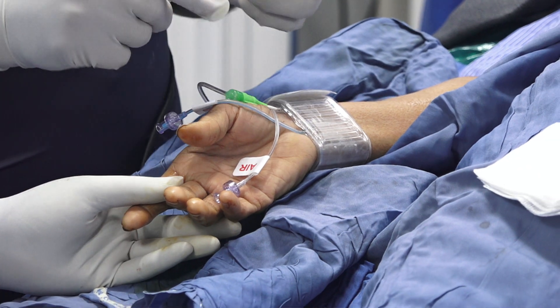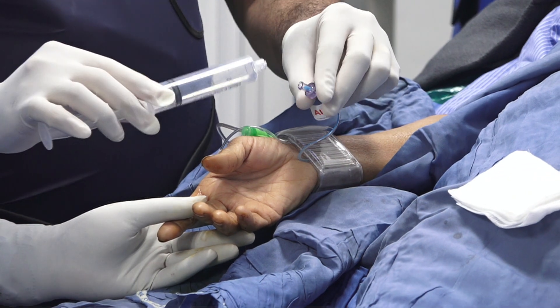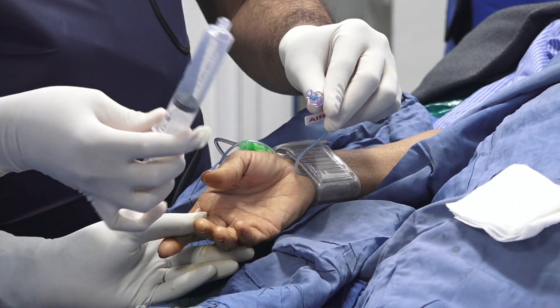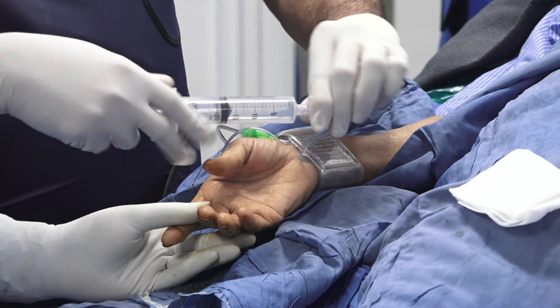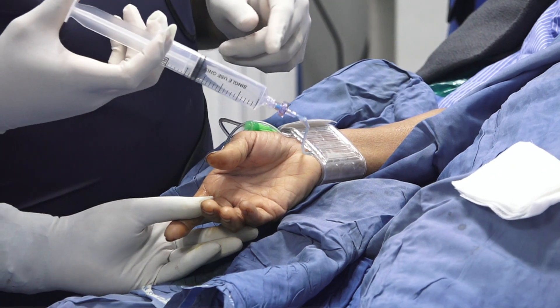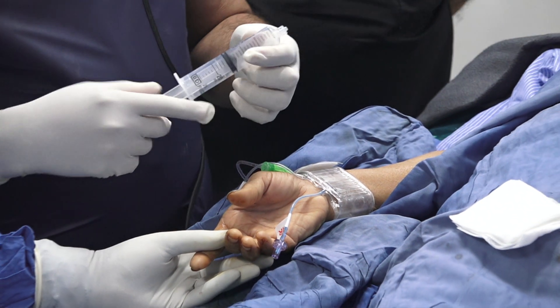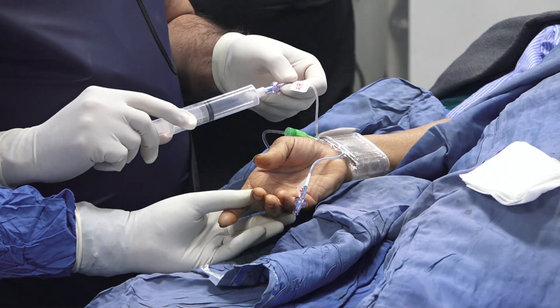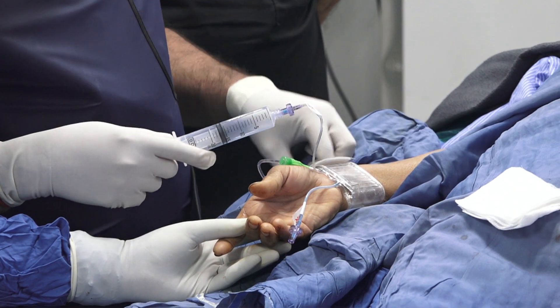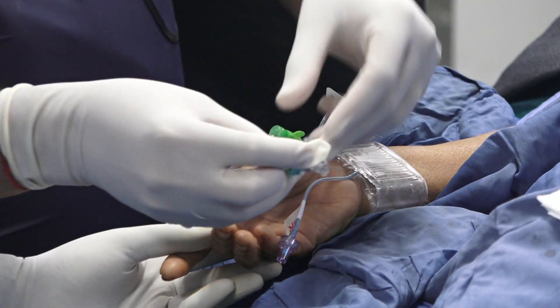Take a 20cc syringe. The rule is very simple: tight ulnar and light radial. We take 15 to 20cc's of air, connect it to the ulnar balloon here on the blue, and inflate it. By doing this, you are augmenting the radial flow about 40 to 50 percent easily. We have ultrasound studies showing that, published in Invasive Cardiology many years ago.